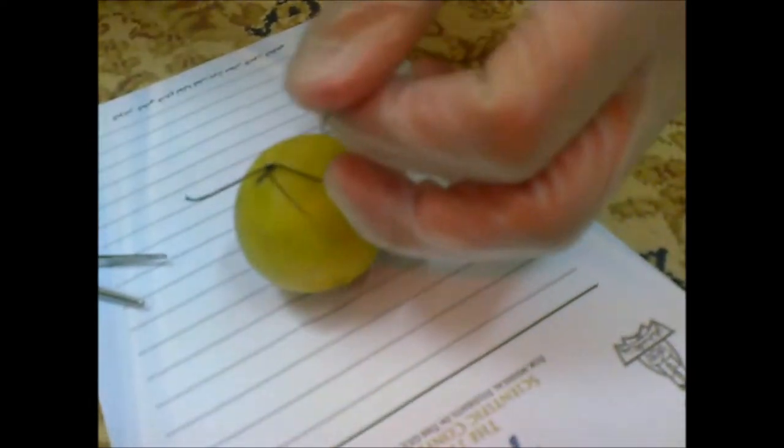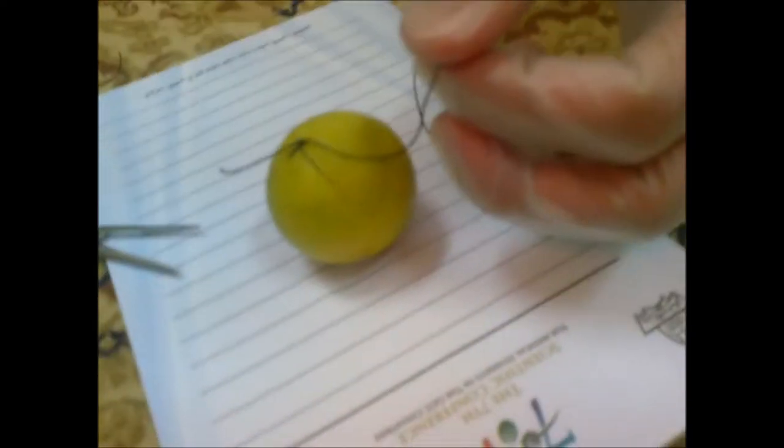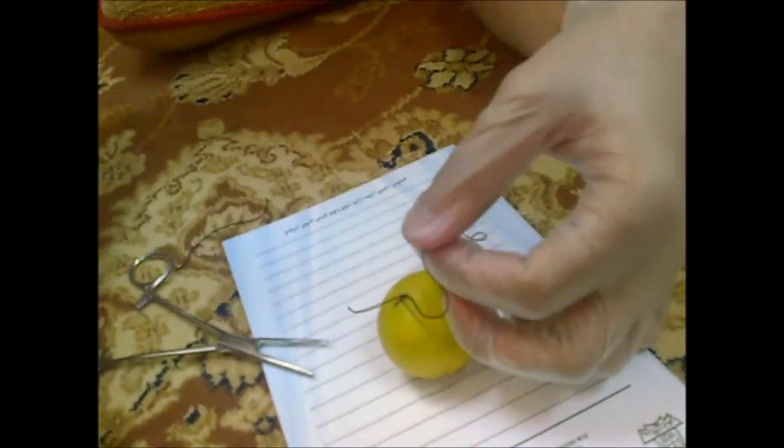And use the scissors. We need more scissors. And you have to cut this.